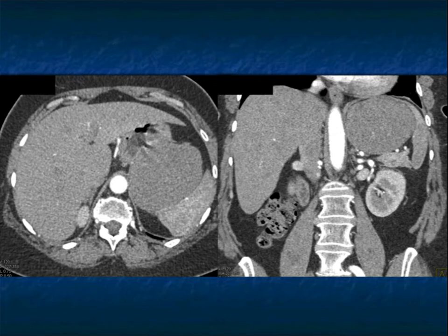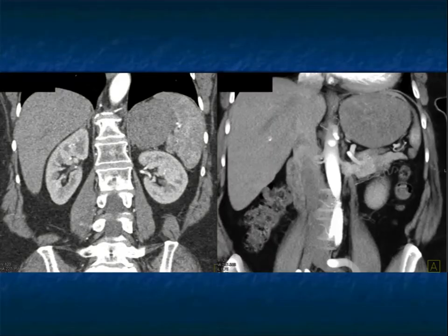Sometimes it's challenging. When you have large masses, the epicenter can be tricky. A key thing, of course, is trying to find the adrenal. If you find the adrenal, you know it's not an adrenal mass. And here's a beautiful, well-defined soft tissue mass — an exophytic GIST tumor.